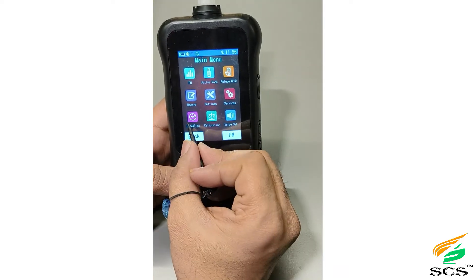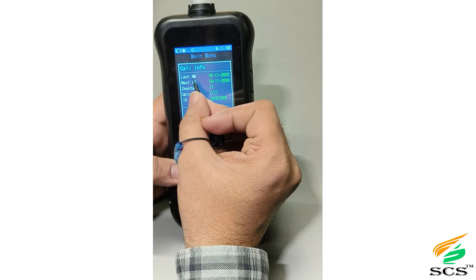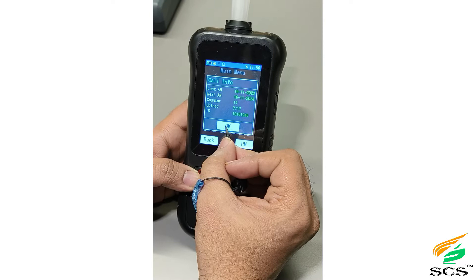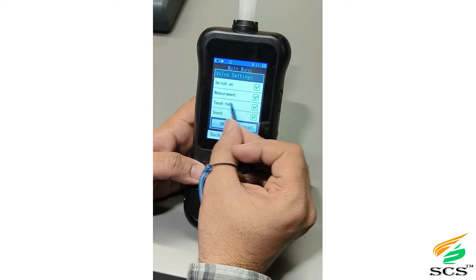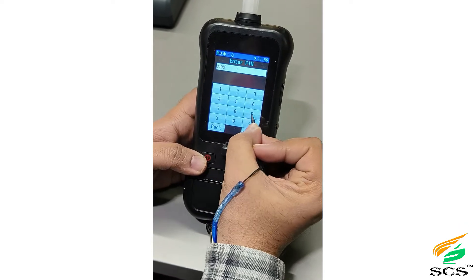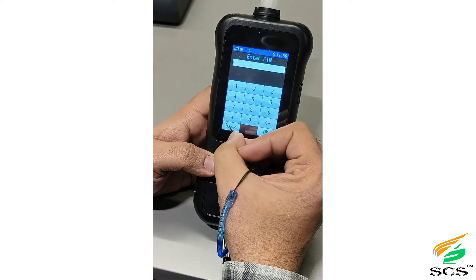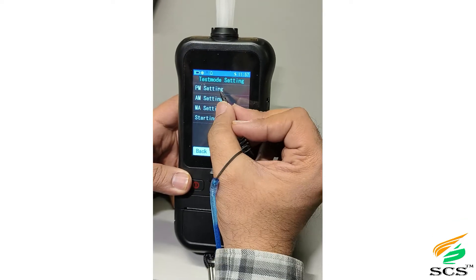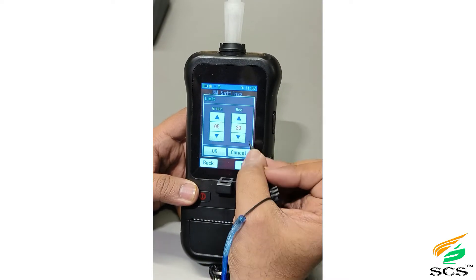This is the date and time setting — from here you can change the date and time. It also contains all calibration details, including when the last calibration was done and when the next one is due. This is the voice setting; by default, voice settings should be on. Enter the password to access Settings. In calibration, you can calibrate the device as part of the service. In Test Mode, you have all active and passive mode options; the user can make settings as per choice, but the result mode will always be quantitative.